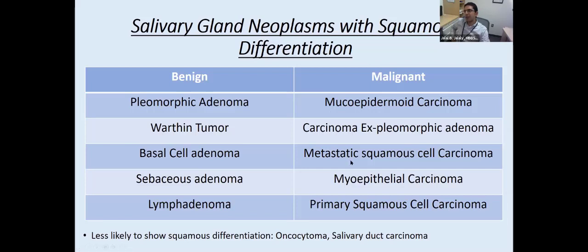Carcinoma ex pleomorphic adenoma, usually those will have a long-standing history of a large mass that was benign and staying there, but all of a sudden started rapidly growing, and that's when you start suspecting a carcinoma ex pleomorphic adenoma. So that's not the history in this case either. Metastatic squamous cell carcinoma is certainly a consideration. It can show up in the parotid gland, and it's certainly more common than primary squamous cell carcinoma of the parotid, which is extremely rare.